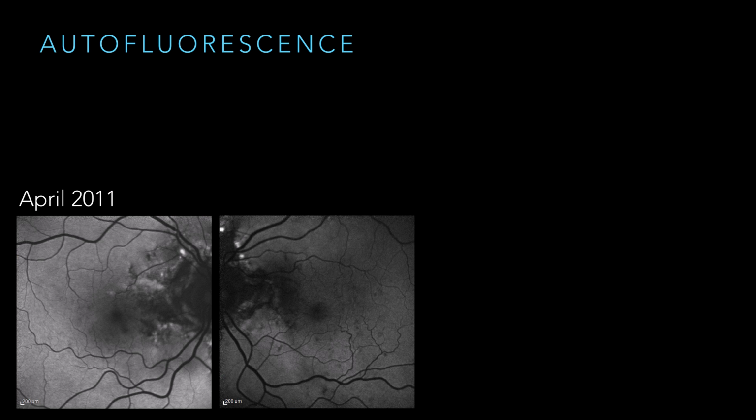This is a patient whose autofluorescence led me to his diagnosis. It seems obvious now, but back when I saw him 3 years ago, I was treating him like he was AMD, and then I looked at the autofluorescence one day and said, that just doesn't look right. Are those angioid streaks? He didn't have any plucked chicken skin, didn't have any peau d'orange in his fundus. And then he said, well, maybe, my sister has this funny skin around her neck. And I was like, well, maybe there's something here.